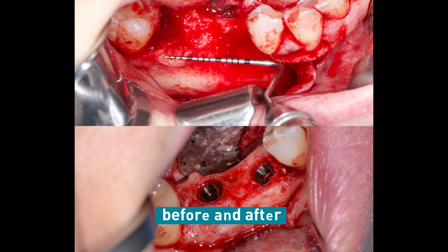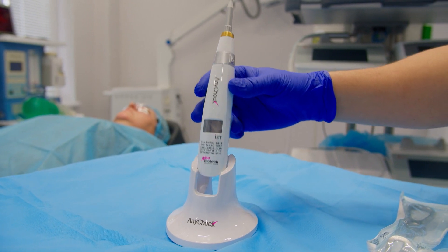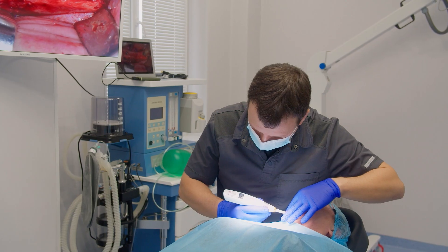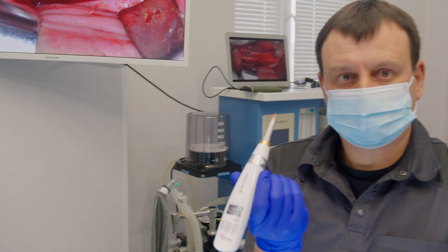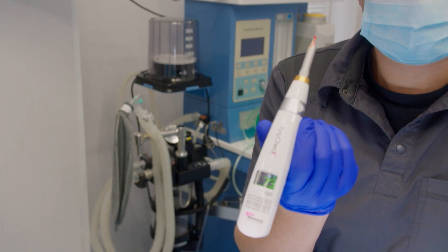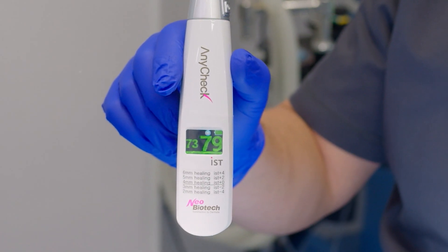To control the treatment, we used CBCT and the Any Check device from Neobiotech company. Any Check was used during implant placement for measurement of primary stability. Now you can see the next checking is done two months after implant placement, to understand the level of implant stability and compare it with the measurement of the primary one.